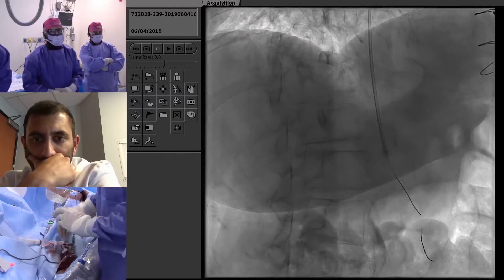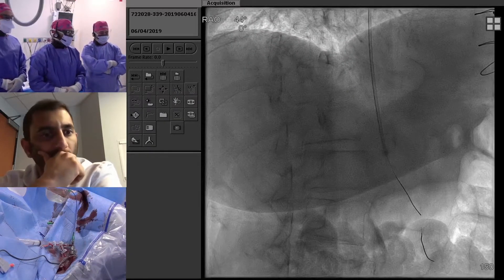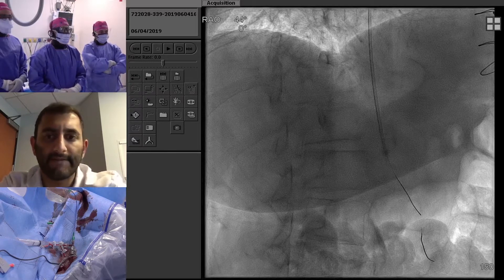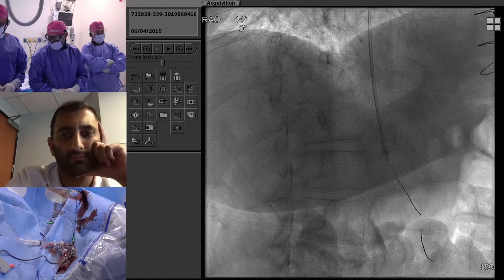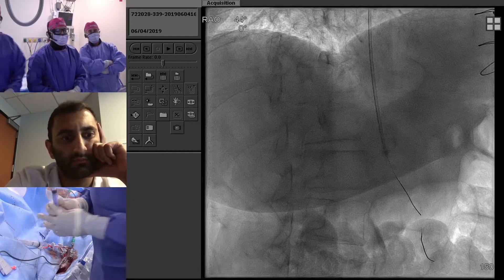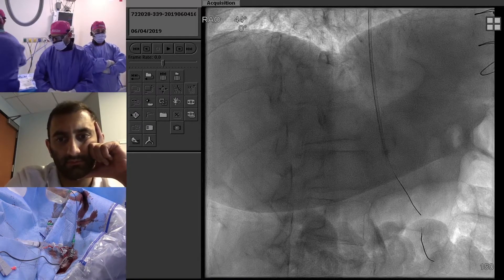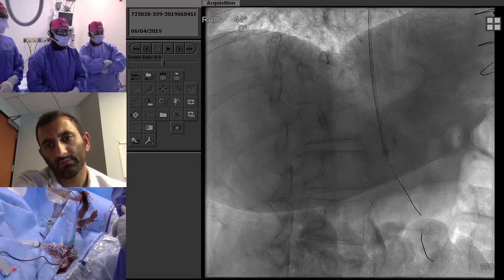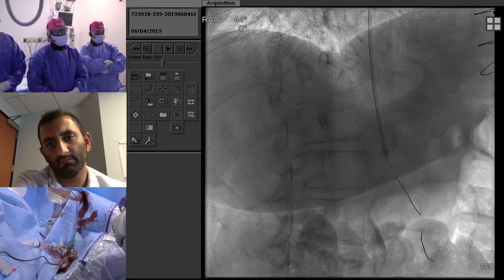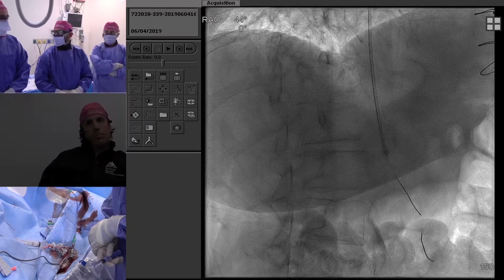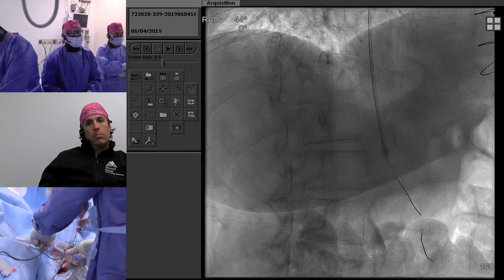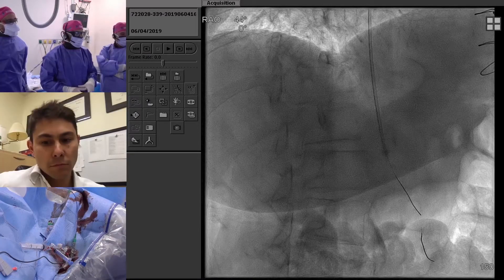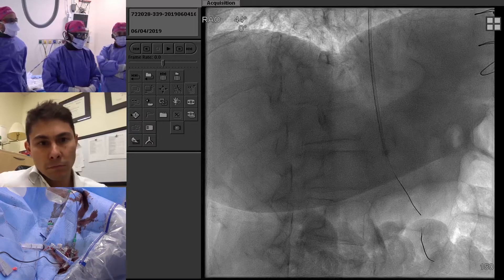The pressure wire is now in. The gradient right now is about five, which isn't that much — varying between two and five. We gave a little nitro to try to accentuate the gradient, and with nitro we got the gradient up to about eight or nine. So she's in a gray zone.